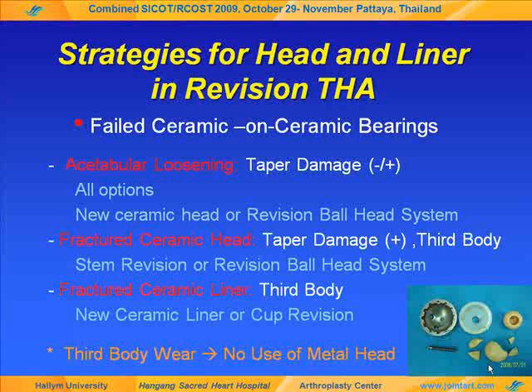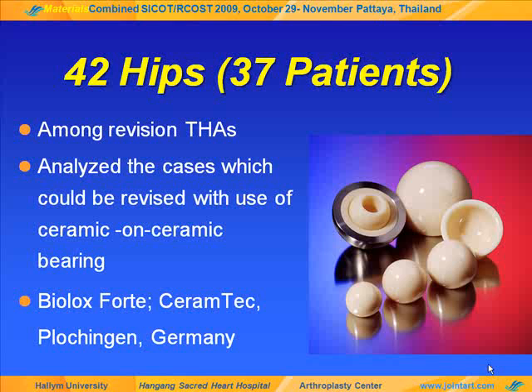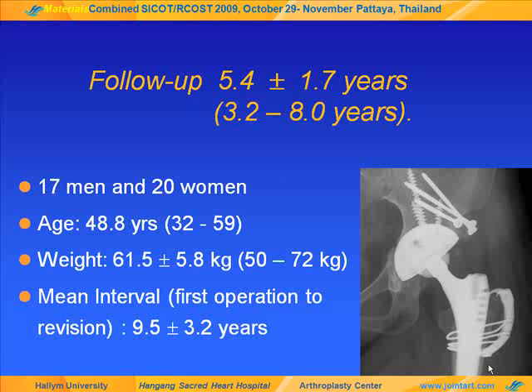The purpose of this study is to evaluate clinical and radiographic outcomes of revision total arthroplasty with use of third generation ceramic on ceramic bearing in relatively young Korean patients. 42 hips of 37 patients which could be revised using ceramic on ceramic bearing were analyzed. The average follow-up period was 5.4 years and average age was 48.8 years.